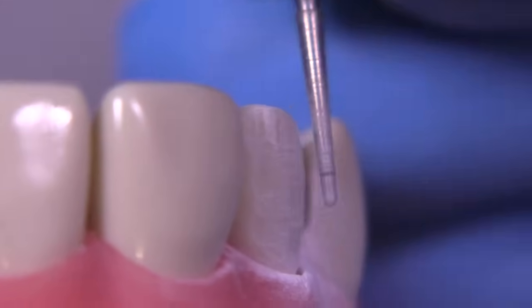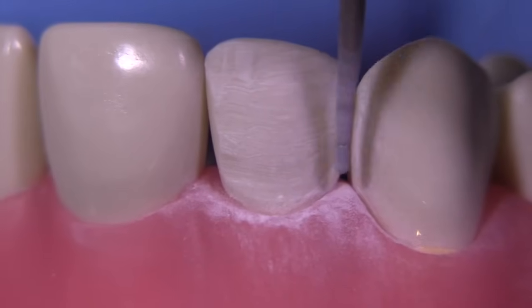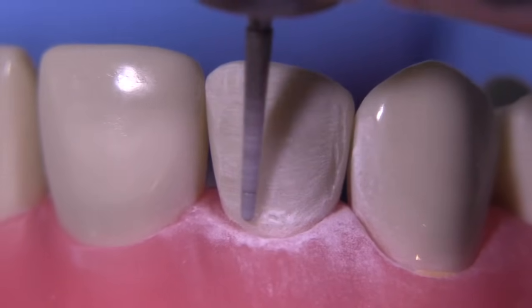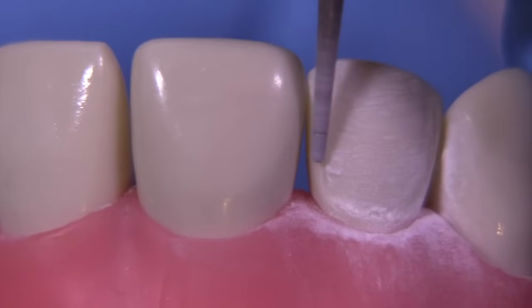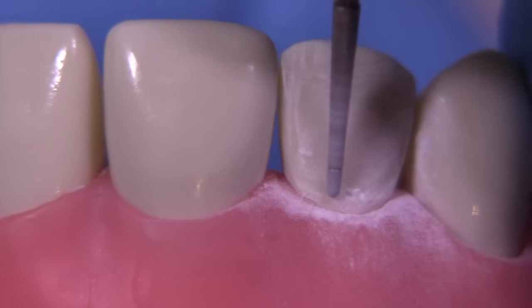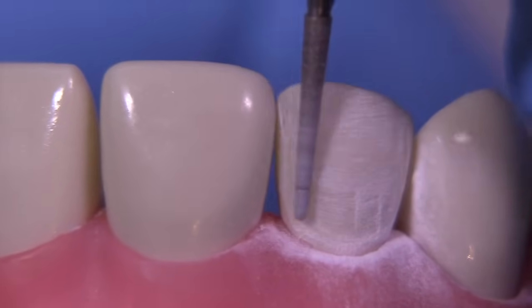And you can see that we're going to keep this particular preparation supragingival simply because I want not to damage the gingiva of the typodont, but you could keep these equigingival. You could even make the preparation slightly subgingival, maybe as much as 0.5 millimeter if you needed to. In those cases, you'd want to use retraction cord to protect your gingiva while you're prepping. I like to prep these usually with rubber dam in place so that we have excellent protection of the tissue, but sometimes the rubber dam hides some important features of the tissue that would give us information about shaping and finessing the preparations.